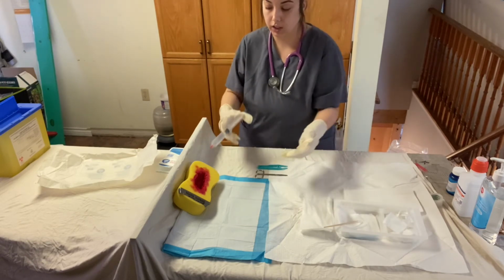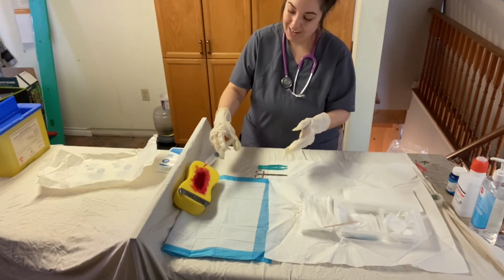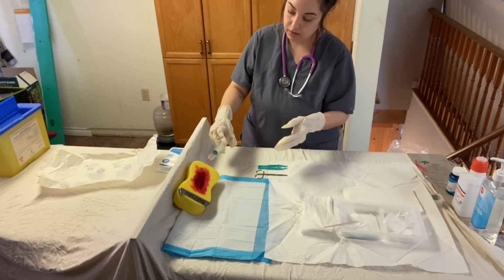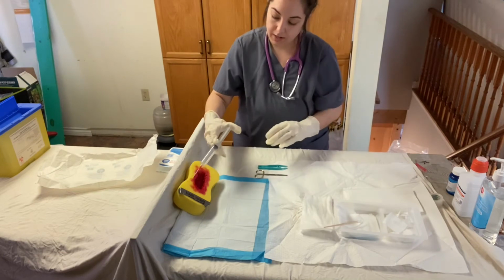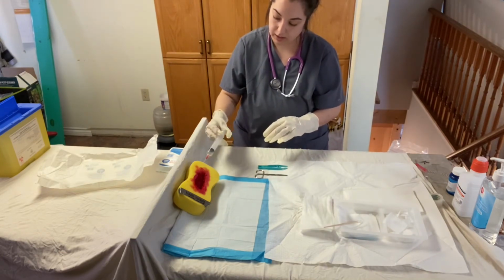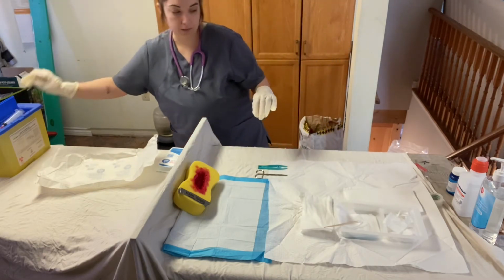I'm going to watch to see, it might be a little cold there, Robert. I'm going to watch to see that the fluid is running clear. Right now it's running pink, so I'm just going to add a bit more normal saline. Are you doing okay, Robert? Perfect. And I'm just going to irrigate a bit more to ensure it's completely clean and it's now running clear. I'm then going to dispose of this into my sharps container.